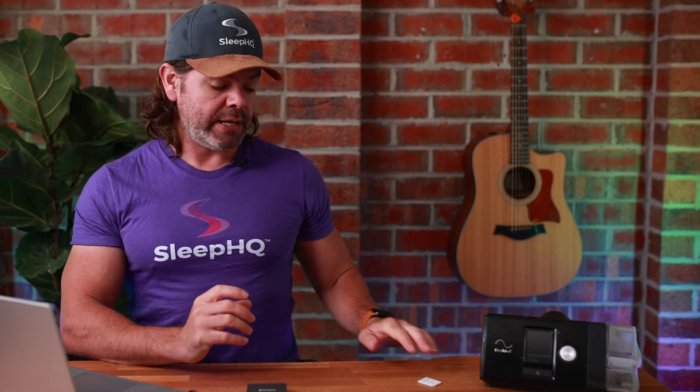Morning, mates. Welcome to the Sleep HQ Academy. In today's lesson, I'll teach you how to import your CPAP SD card data using a Windows-based PC or laptop. We'll take it nice and slow, step-by-step. Let's begin.